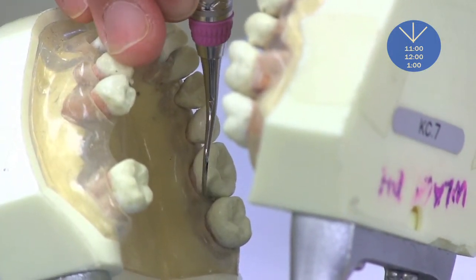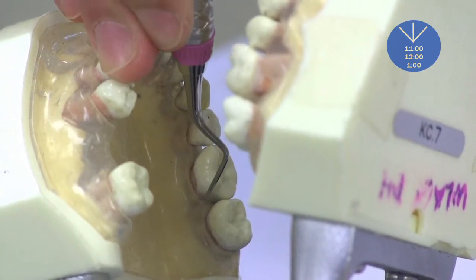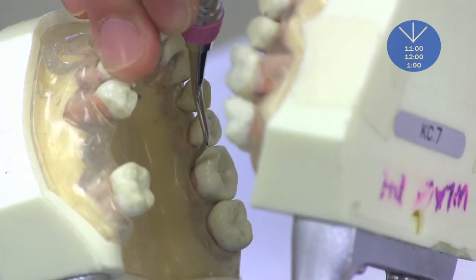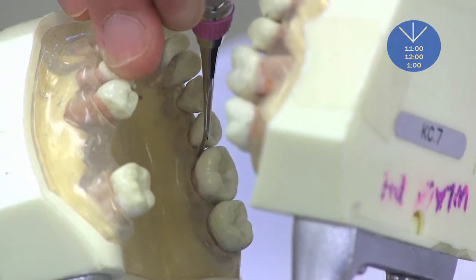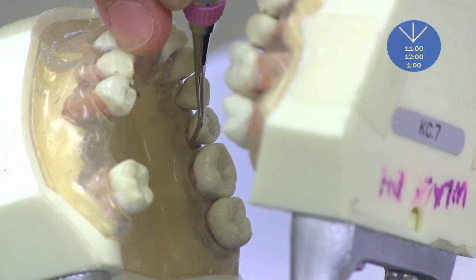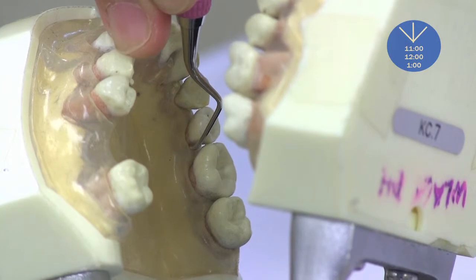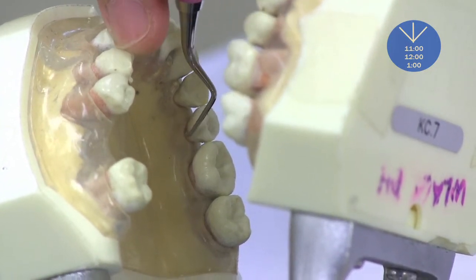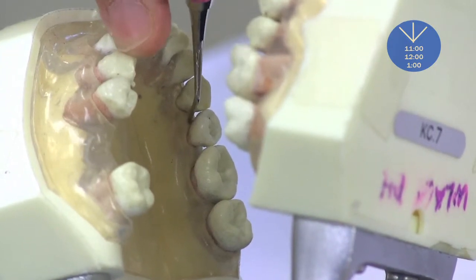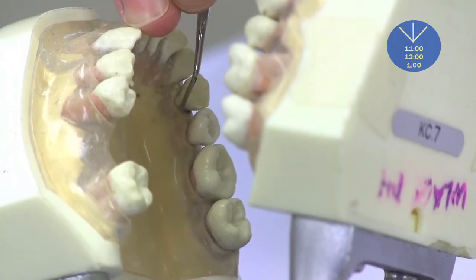Then distal, up and down. Lingual, slightly oblique. Coming around to the mesial and vertical. Distal is vertical — terminal shank is parallel. Lingual, going interproximal with a vertical stroke again. Distal-lingual line angle, vertical strokes.